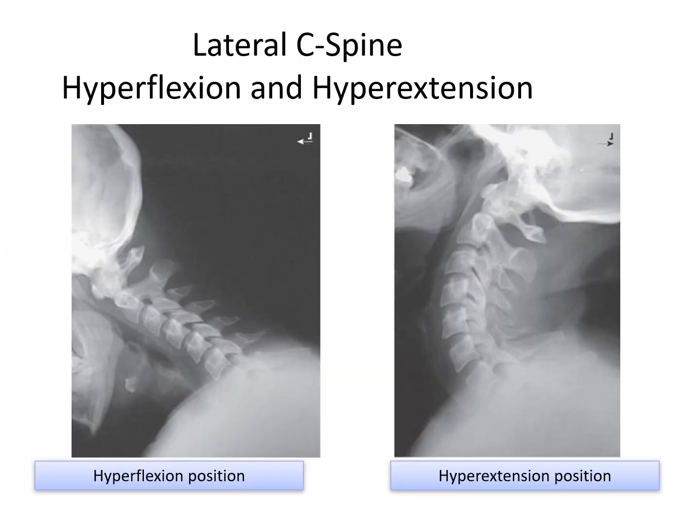All right, so there's your flexion extension views. Again, normally this is post-surgery, but it could be pre-surgery. It could be that this is the before picture. Then they're going to do a fusion, and 6 weeks after the fusion, they're going to do this series again, to see if the patient lost any range of motion. You would expect that the vertebral bodies that are fused don't move relative to each other, that's what a fusion means. So they are going to lose some range of motion with a fusion, but it's a good idea to evaluate that. The neurosurgeon weighs that as to how well the case went.